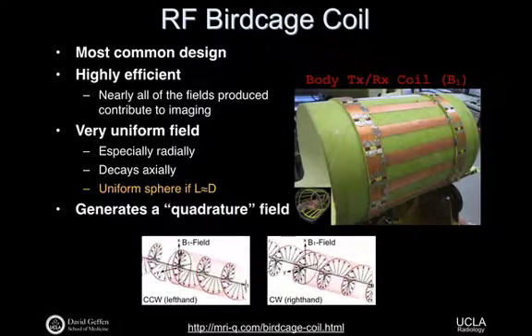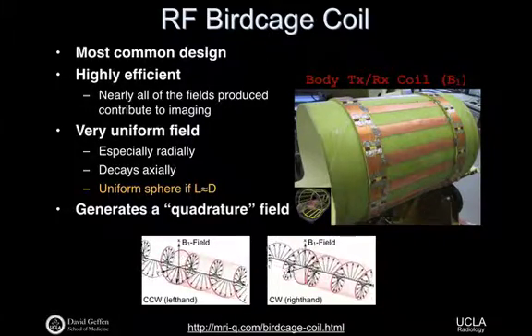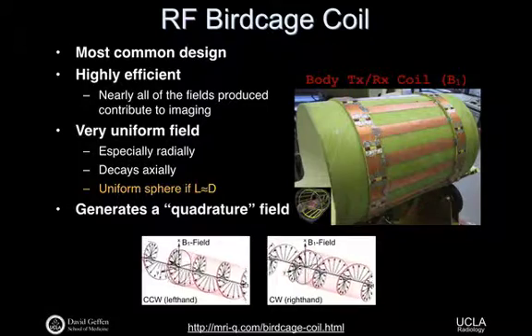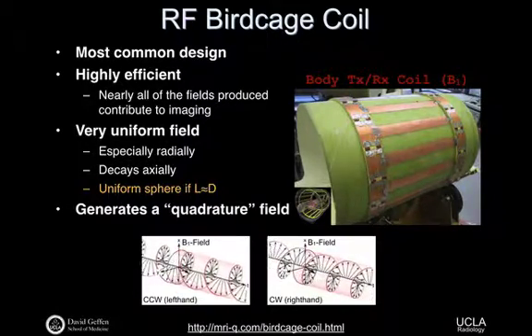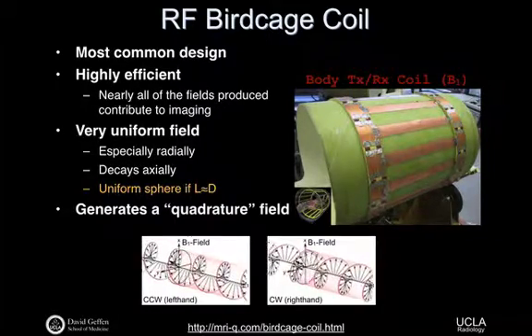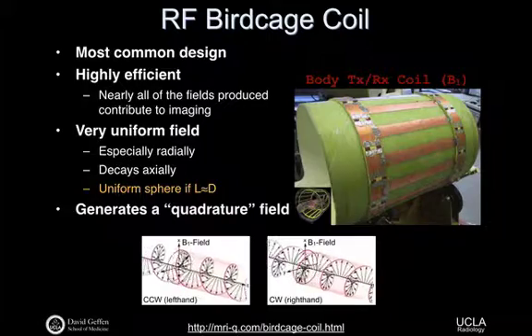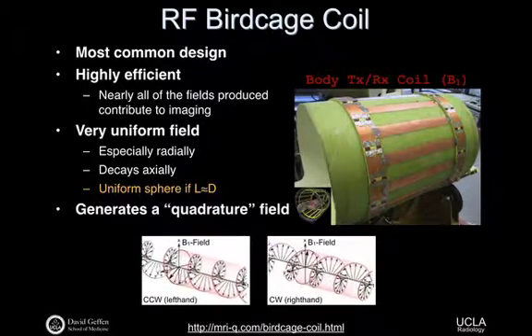So this is a teardown of the coil that's sitting inside the scanner. They call it a bird cage just because the copper elements look a little bit like a bird cage, right? And the patient is going to slide inside on a nice comfortable scanner bed, slide inside this B1 coil. Outside to the B1 coil is the gradients. Outside to that is the B0 field. We'll come back to gradients later.